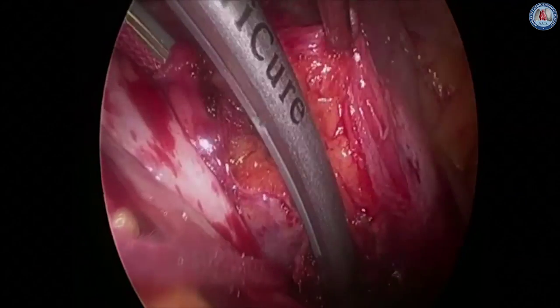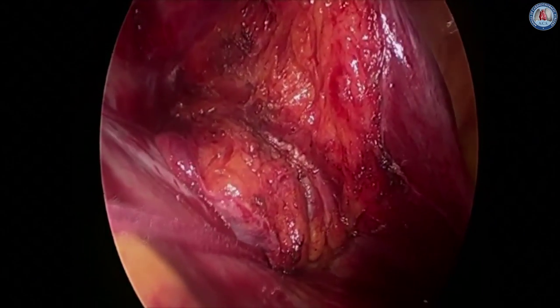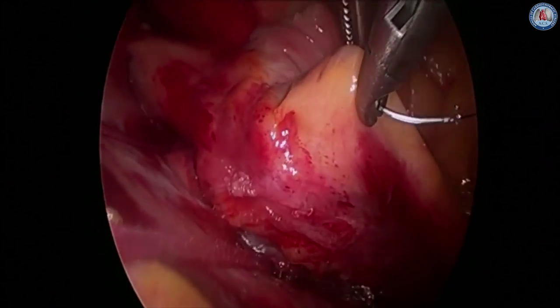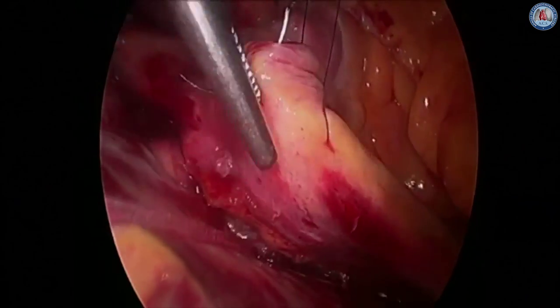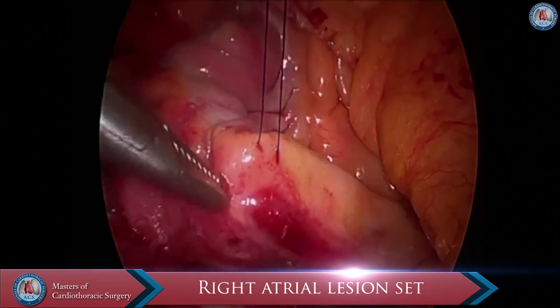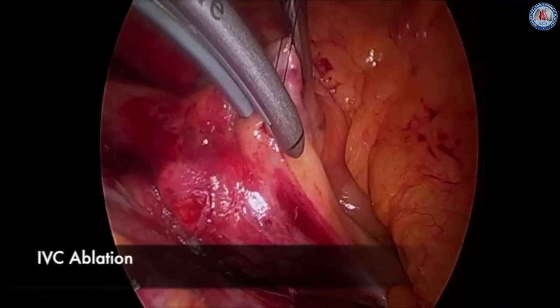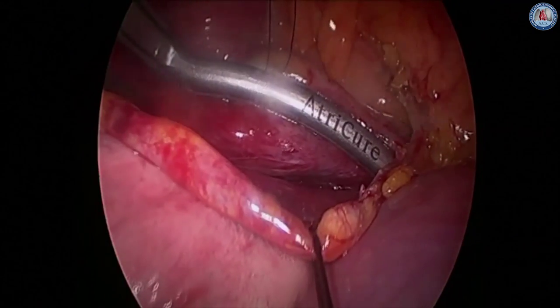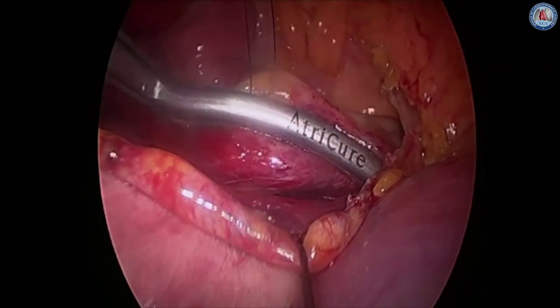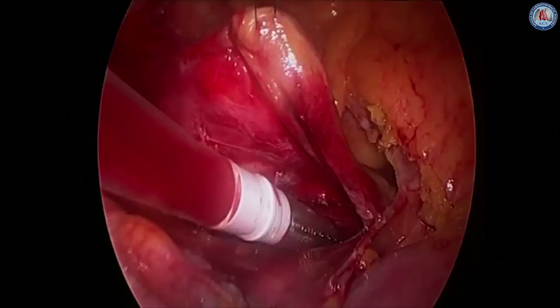The ablation is actually performed on this cuff of left atrium and not on the veins themselves. Usually three ablations are performed. Testing is then performed in order to confirm exit block from both the superior and inferior right pulmonary vein. A purse string suture is then placed in the right atrium just above the intraatrial septum and midway between the superior and inferior vena cava. A 4-O proline is used for this purse string. The bipolar clamp is then used to perform an ablation down onto the inferior vena cava, with one jaw of the clamp inside and one jaw outside the right atrium. For every ablation line created, usually we perform two to three clamps of the bipolar device.